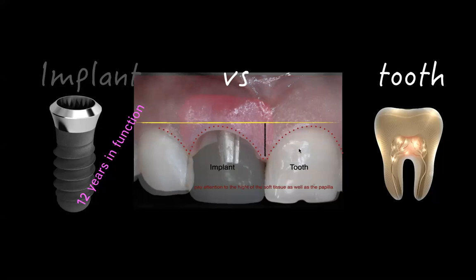Now, if the patient will lose this tooth and now will place another implant, that's going to be a different story, because now you're taking out the source of support for this papilla. Now, this area will be completely a different story.